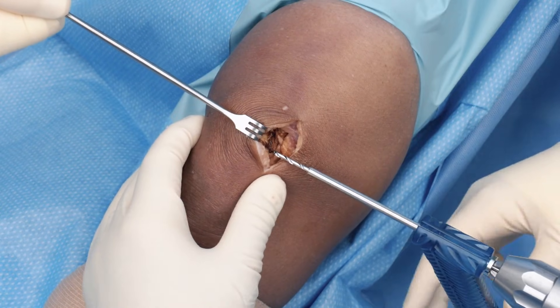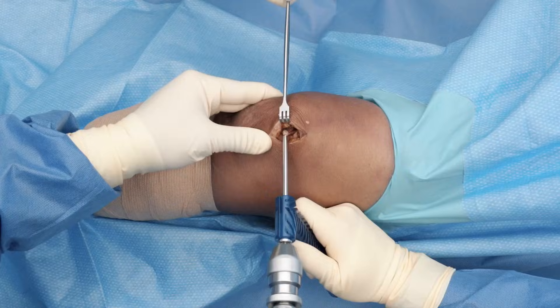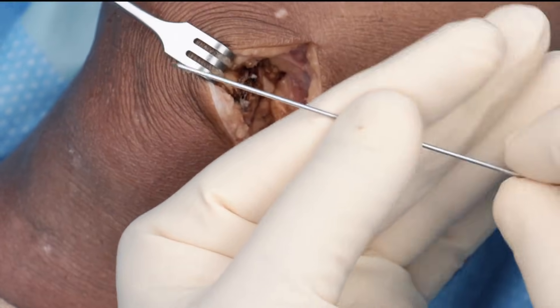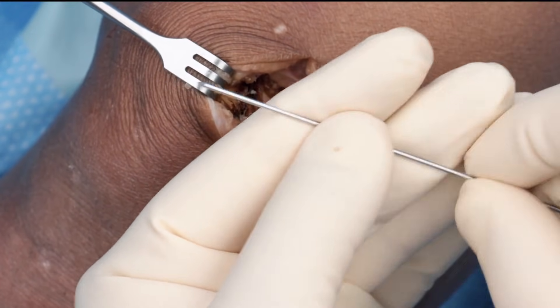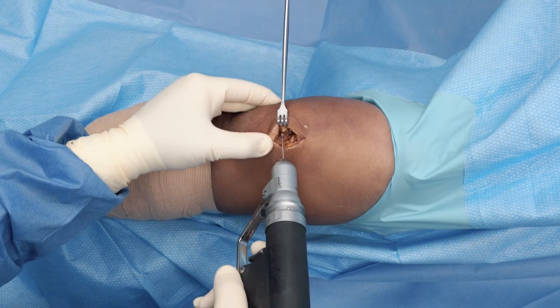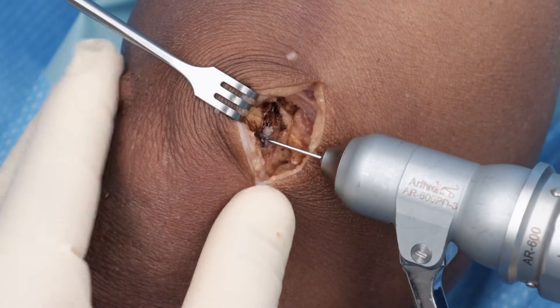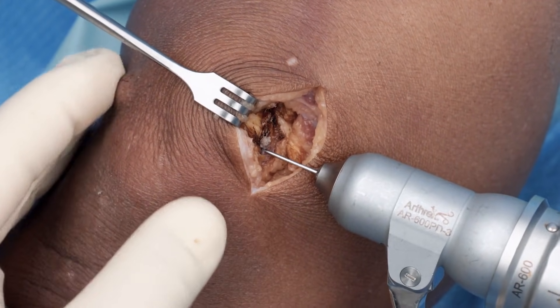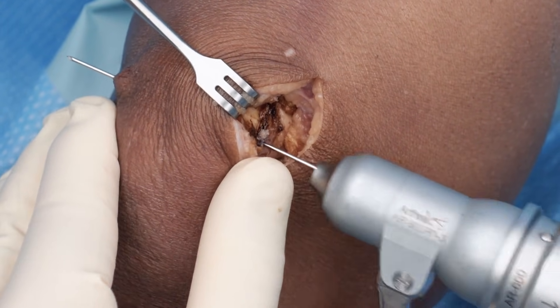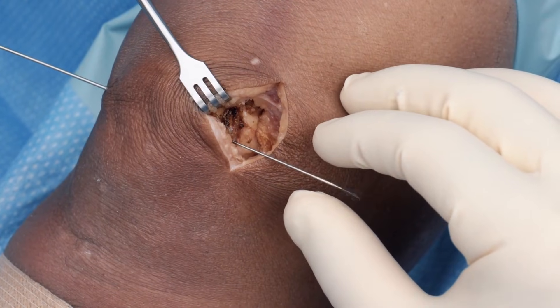First, I'm going to show the drilling of the 2.6 millimeter drill, and that is bottomed out. The next step is using the K-wire with the nitinol loop. When you're driving the K-wire in, it is critically important to make sure you drive the larger diameter portion of the K-wire. I find the socket I just made — this is the 2.6 socket — now it's bottomed out in the socket. Drilling, and you will feel it's popped through the lateral border, and I can see the tip of the pin under the skin. Now I've gone through the skin and I can grab it on this side. I can feel that it's going through much easier because the larger diameter is already through.